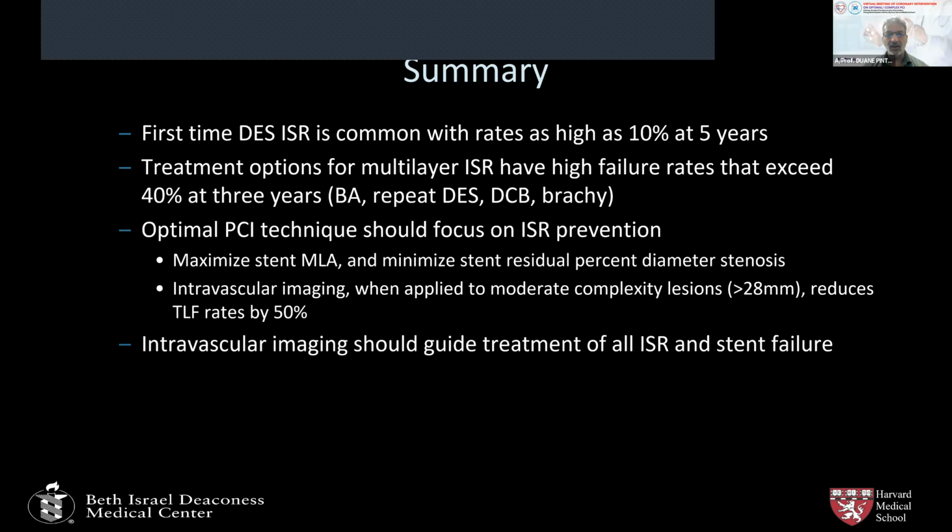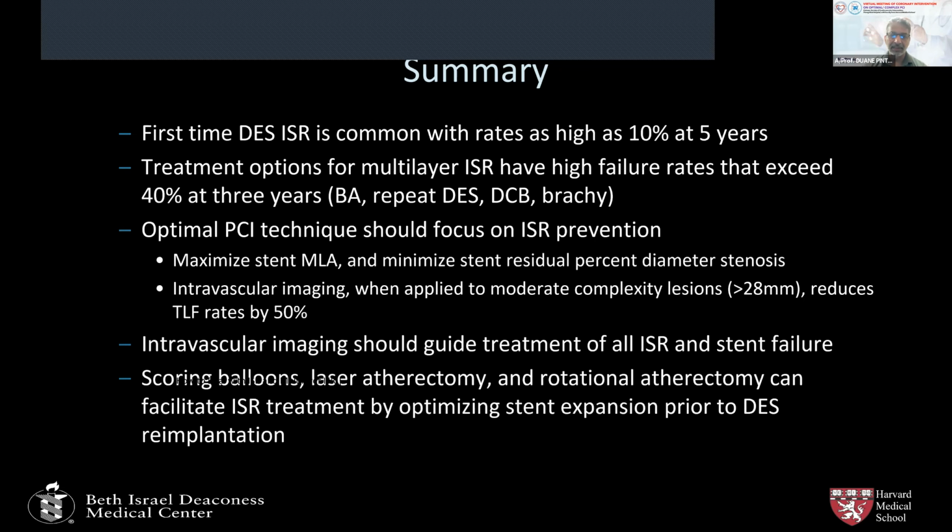Intravascular imaging should guide all ISR and stent failure treatment, and scoring balloons, laser atherectomy, and rotational atherectomy can facilitate treatment by optimizing stent expansion prior to another DES implantation.